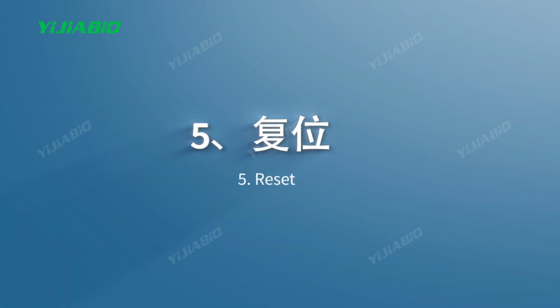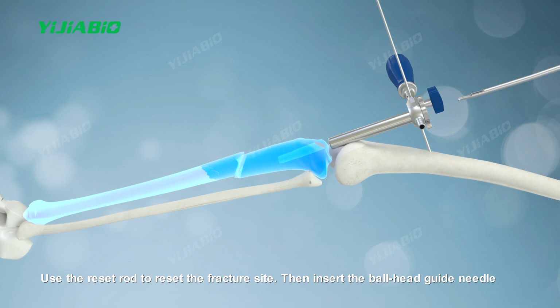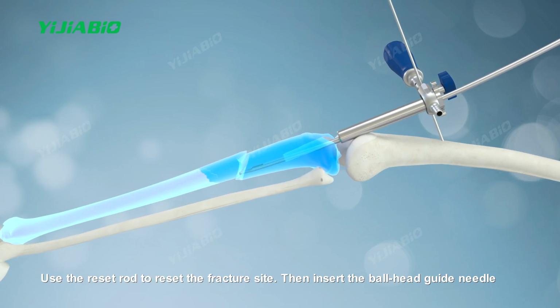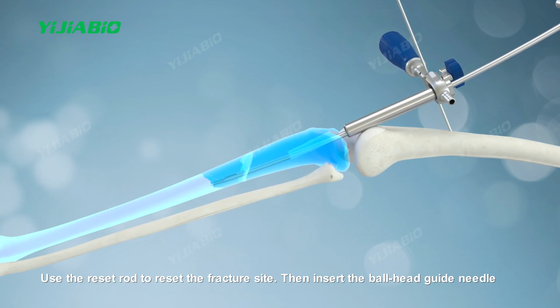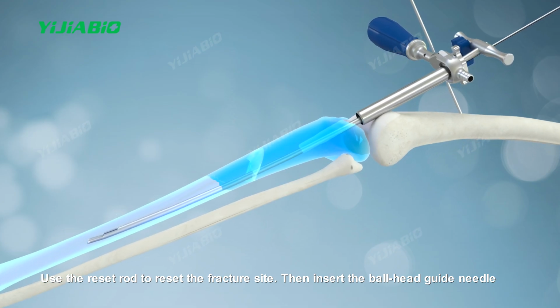Five, reset. Use the reset rod to reset the fracture site. Then insert the ball head guide needle.